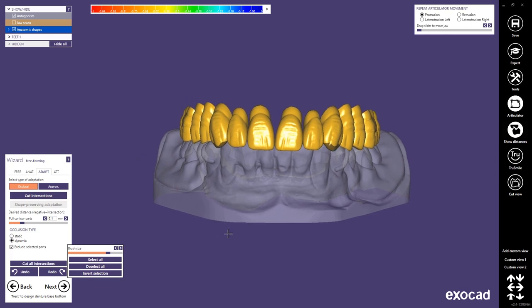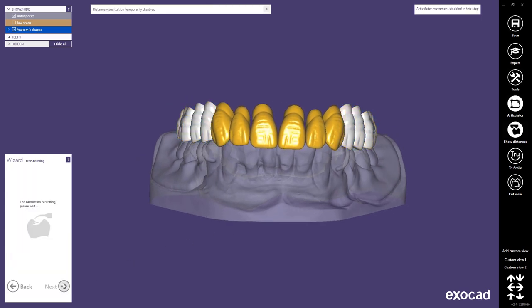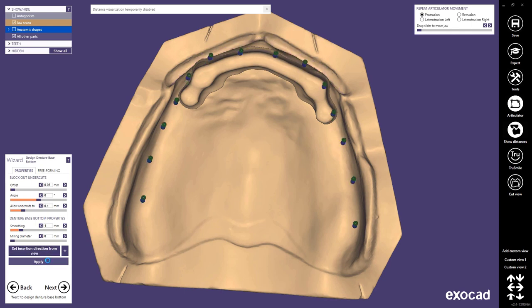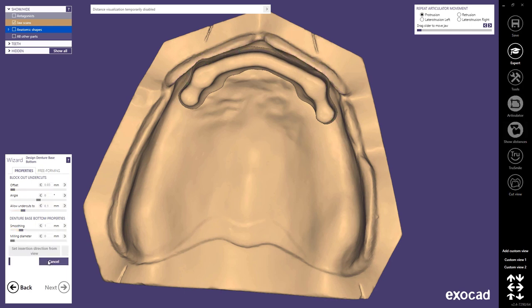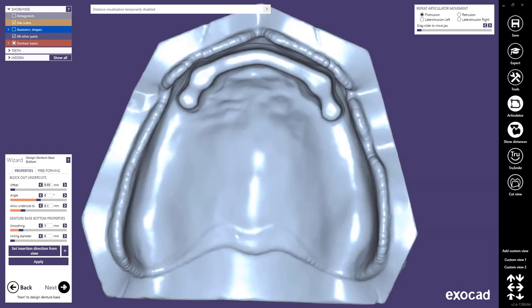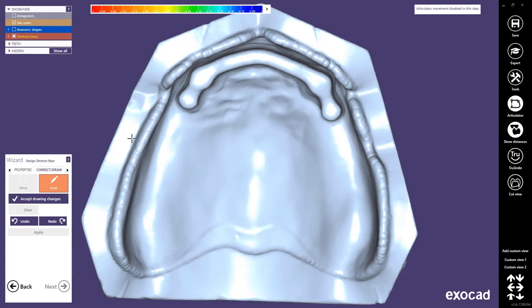Once you're happy with your setup you simply press next. In the next step you design the bottom of your full denture base. Simply select your insertion axis and press apply. You can change all of those parameters based on your printer or milling machine if there's need for it. Once the calculation is finished you see the bottom of your denture base. Just press next to get to the step where you can draw your finish line of your denture. You have the option to draw the finish line yourself manually, but if you click on the small arrow you get the detect option.